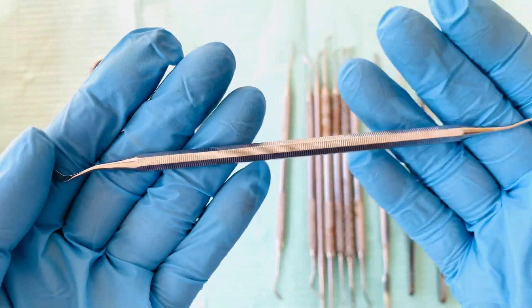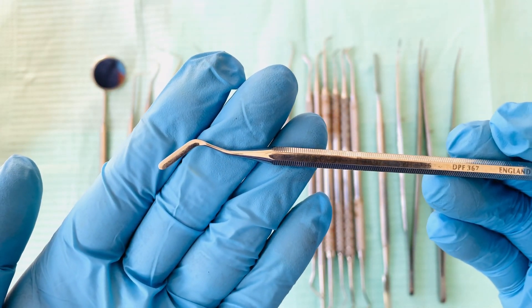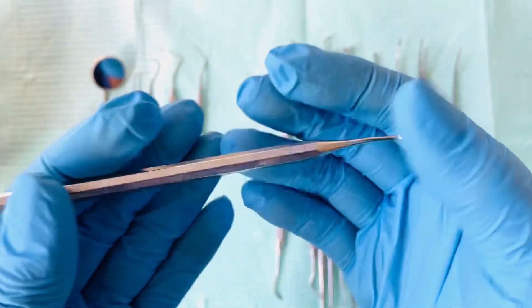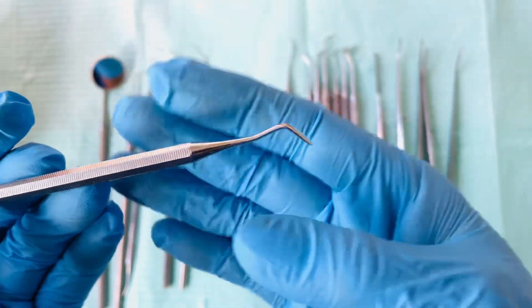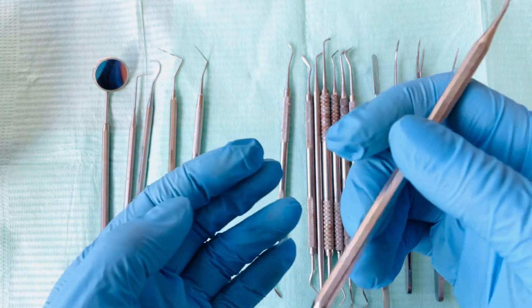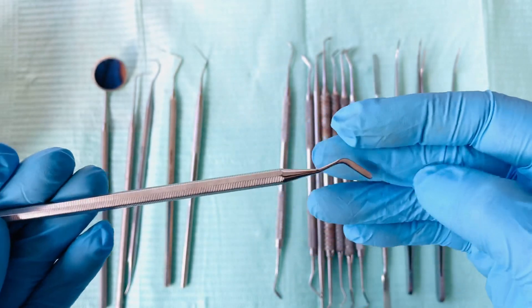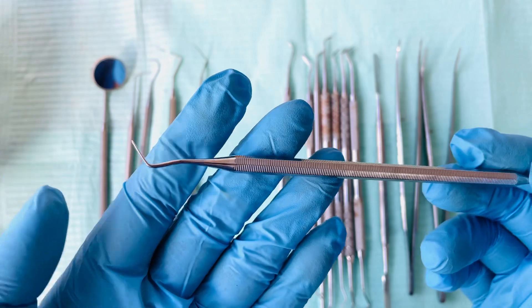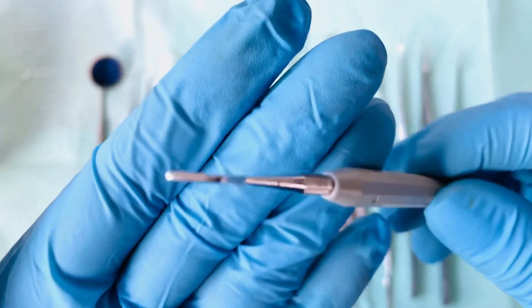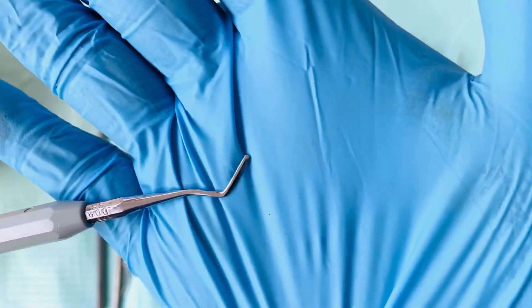Next we have the flat plastic. It is a double-ended instrument — that's one end, and on the other end that is how it looks. This is used in composite fillings: it's used to pick up the composite and plug it into the cavity preparation. The flat plastic comes in different colors — you have a gold one — and it can also come in a narrower width.